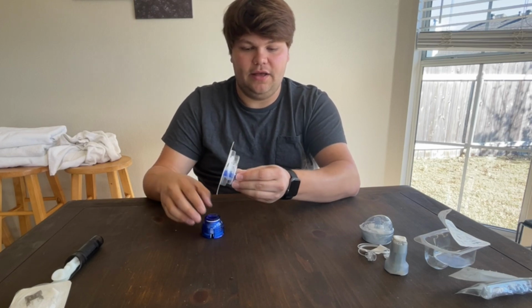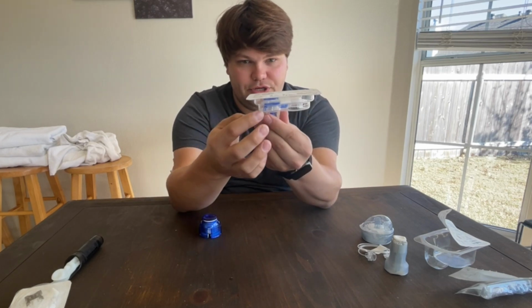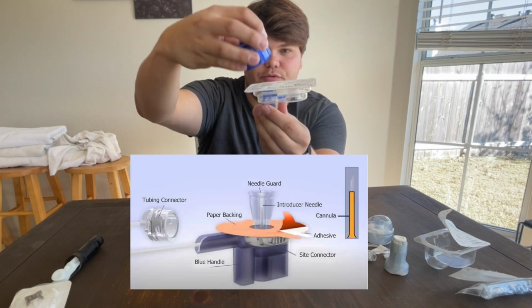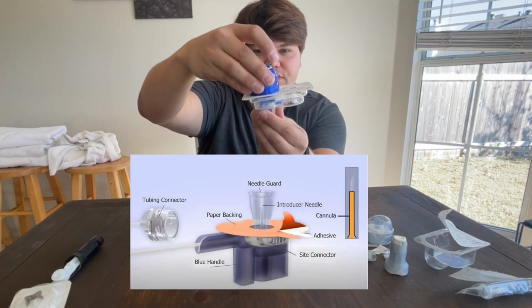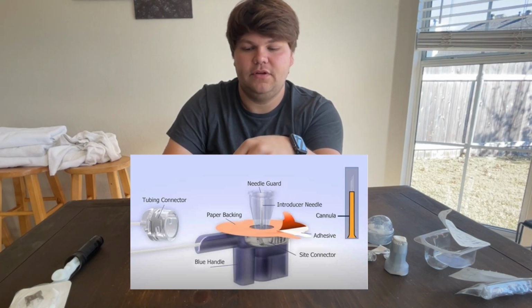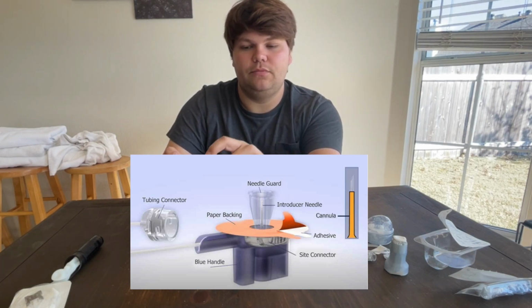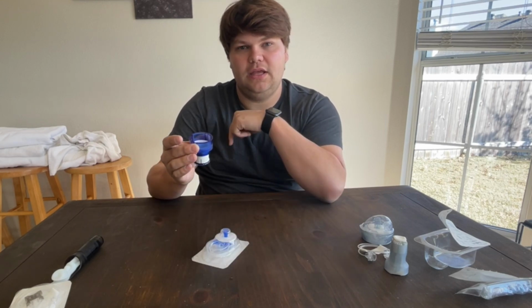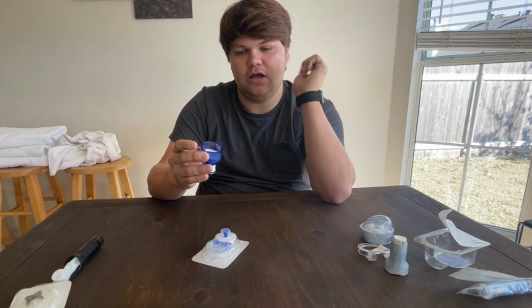Basically, it's kind of hard to see, but you can see that the blue top piece up here has a certain way that it fits inside the inserter. Once it's in there, you can remove the adhesive. Then this little blue clip or blue piece at the top will allow you to push it in to get it ready, and then that will twist off.